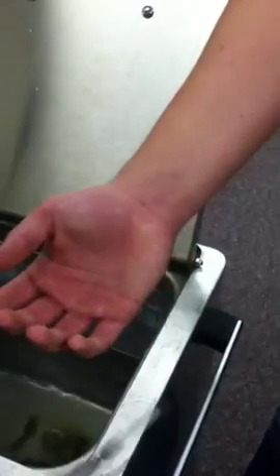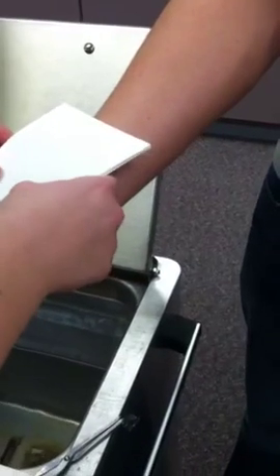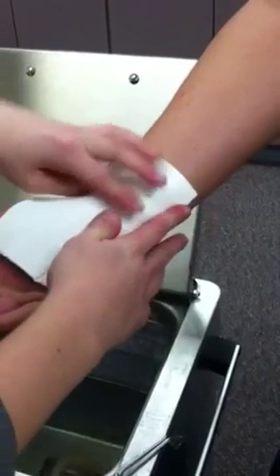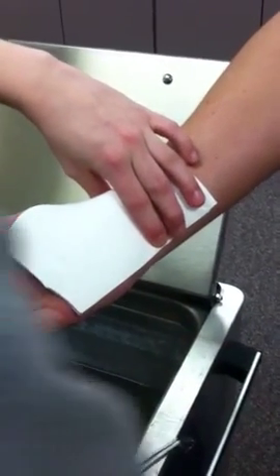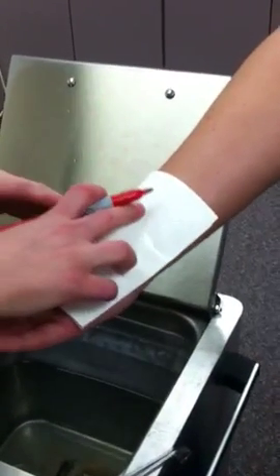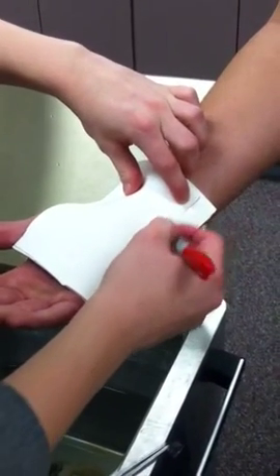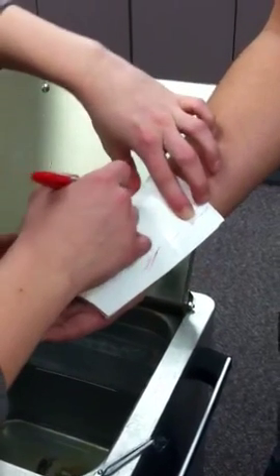You will mold it to the patient, to the body part that you're concerned with. You'll get a semi-mold, and then you have about 2-3 minutes till this starts to harden. You're going to mark out the bony landmarks with a Sharpie and simply mark it out.